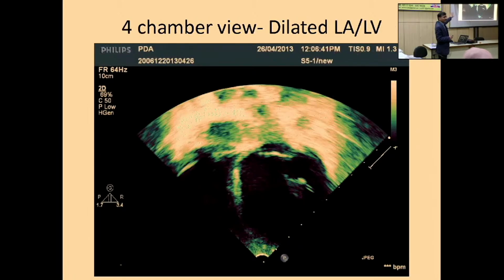So if you have right side dilatation, this means Eisenmenger, not severe. Severe is always there in a large shunt. That is not the question. The question is severe hyperkinetic or severe obstructive. Hyperkinetic means operable, left to right shunt. Eisenmenger means right to left shunt, and then the right side chamber will dilate, not left.